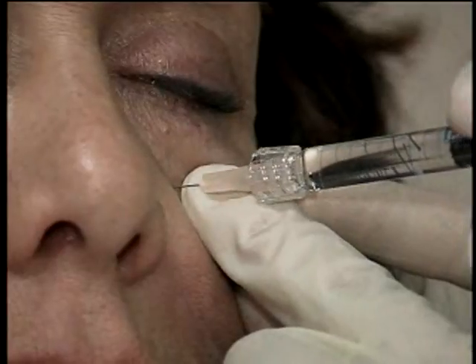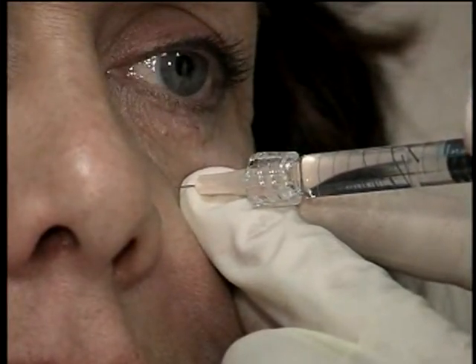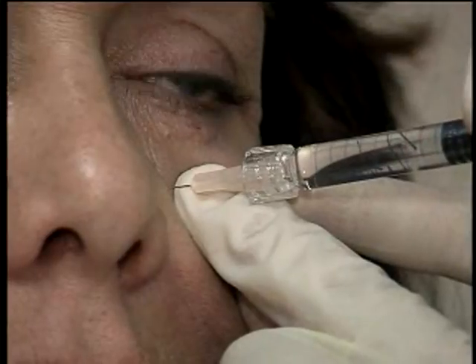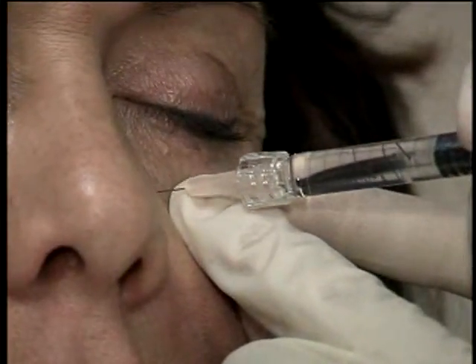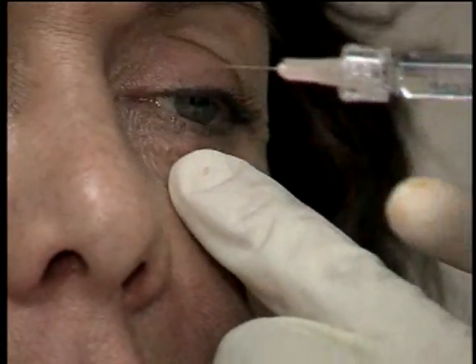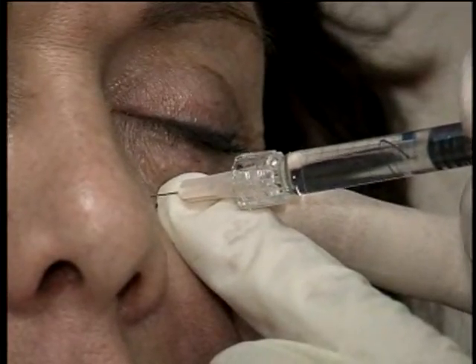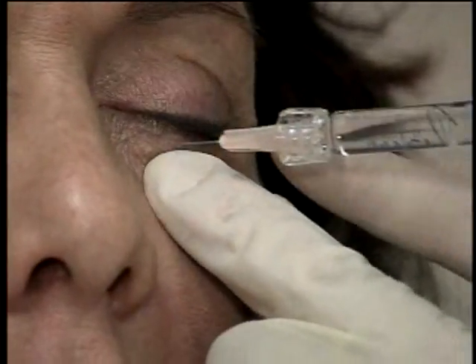This area frequently bruises too. Once I get to the nasojugal groove, make sure I'm deep. There's a lot of muscle in this region. For that reason, this area tends to bruise a little bit more from bleeders within the muscle.